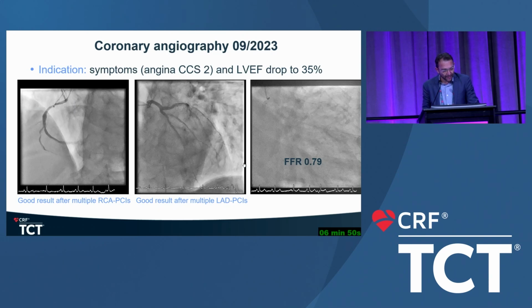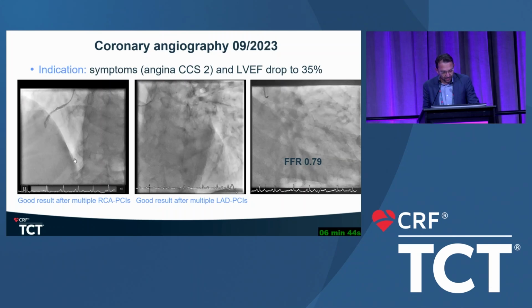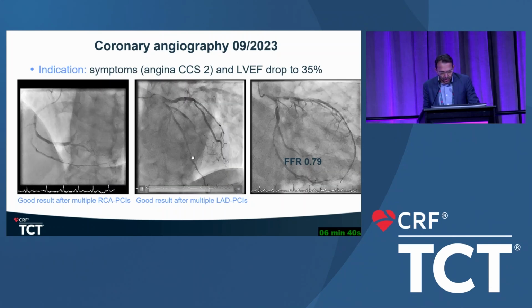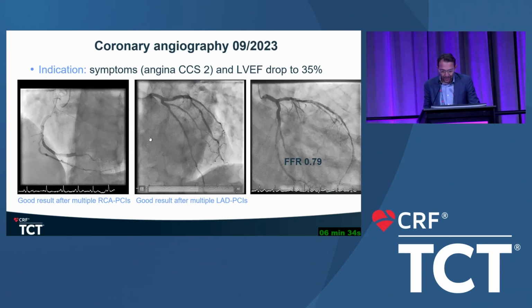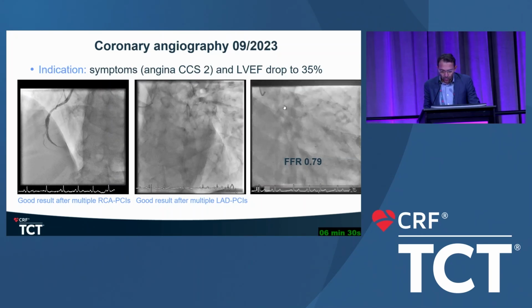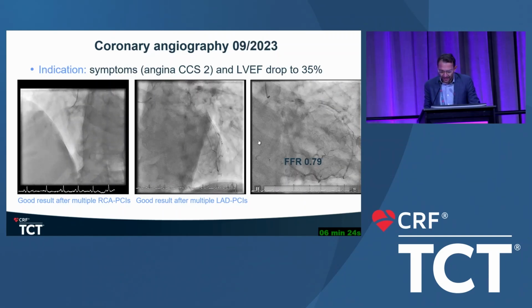So the patient got a recath. This is the RCA with a known CTO of the posterolateral branch, which was not addressed before. This is the LAD after 2 stenting procedures. Also, the diagonal branch was stented. Apparently, at least angiographically, we judged that to be a relatively good result. And there was a new lesion in the circumflex artery, which was not described nor present at angiography before. It's an intermediate lesion, in fact, not a dramatic one.